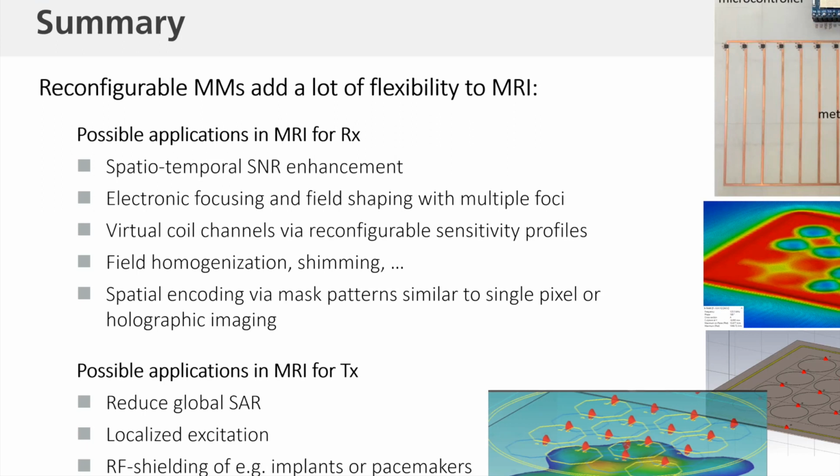Yeah, so we are essentially using an SPI interface. And so you can control each one independently.